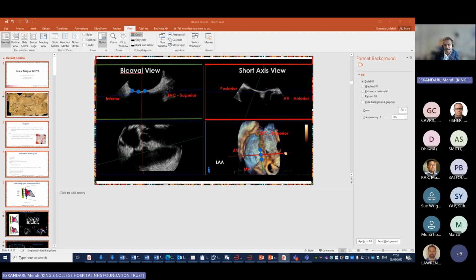For transcatheter edge-to-edge repair, you puncture at the mid part. For LA appendage occlusion, you puncture the inferior part. And if you have a paravalvular occlusion, you want the medial side, for example, so sometimes a superior puncture would help. So the bottom line in summary is that SVC, IVC determines your trajectory, and anterior, posterior then gives you the distance from the mitral valve.